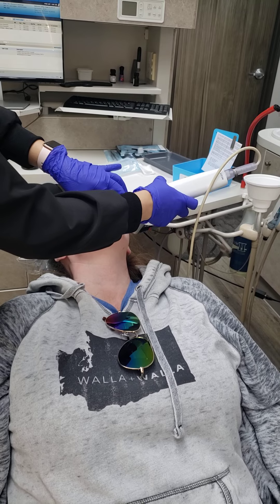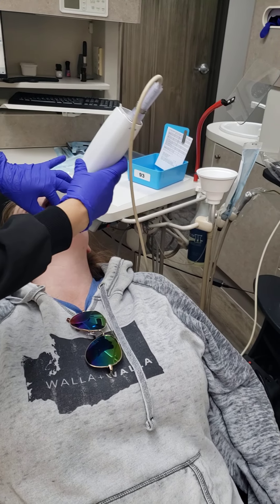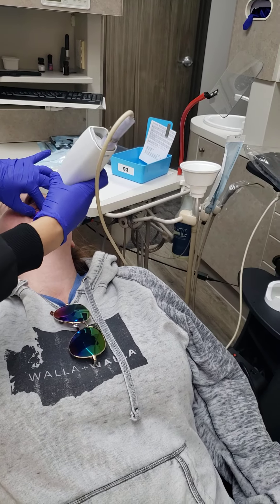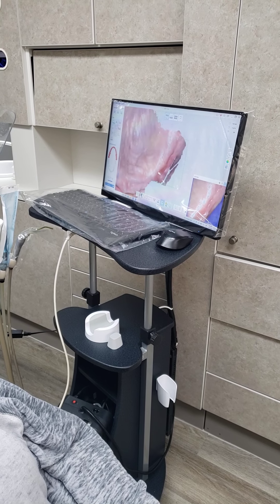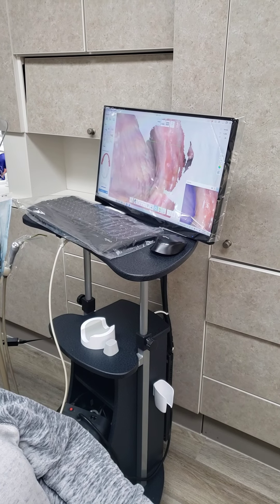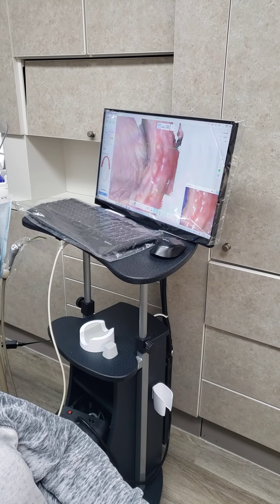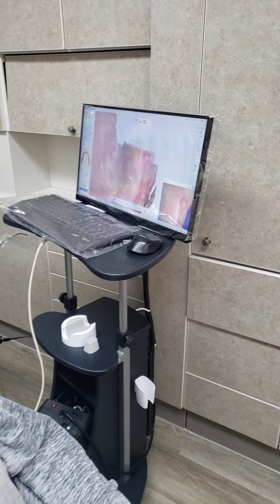You've been waiting to just look about her. I almost see you. Because I had a digital denture, but I think I was like the first one. It's basically scanning the inside of her mouth and then giving you a layout on screen. It's like a 3D... Oh! That is so cool. Isn't that cool? It is. It's very interesting.